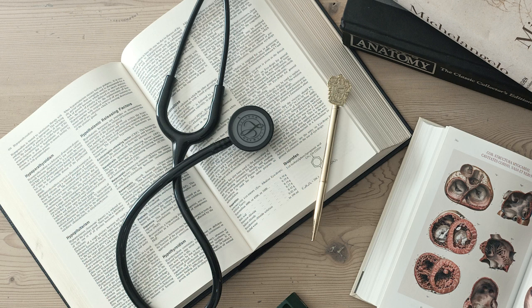On the ECG, you'll observe no distinct P waves. Instead, you see multiple irregular low-amplitude fibrillatory waves, F waves, which are chaotic and often just look like a wavy or coarse baseline, especially visible in leads like V1. No P waves, just fibrillatory waves and irregular QRS. Exactly. The hallmark is the irregular ventricular response, varying RR intervals. The majority of the QRS complexes will still be narrow, confirming the supraventricular origin.